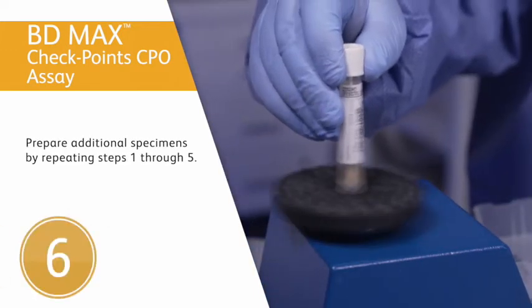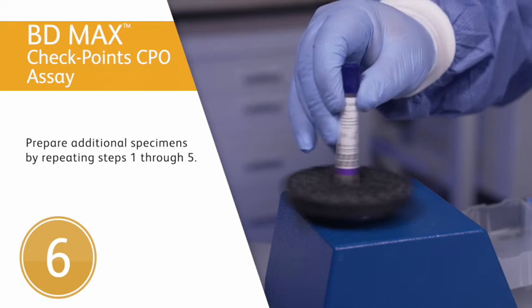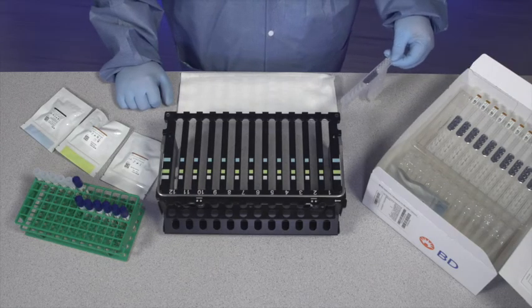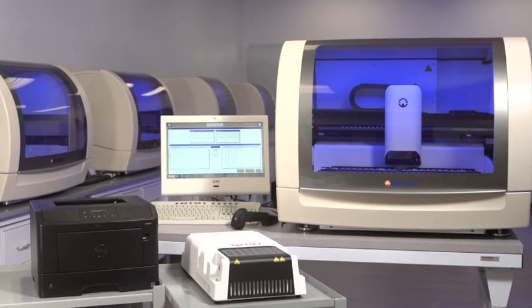Prepare any additional specimens by repeating steps 1 through 5 for the remaining specimens, ensuring gloves are clean prior to handling additional specimens. Now proceed to the BDMAX system operations section in the assay-specific instructions for use to perform testing on the BDMAX system.